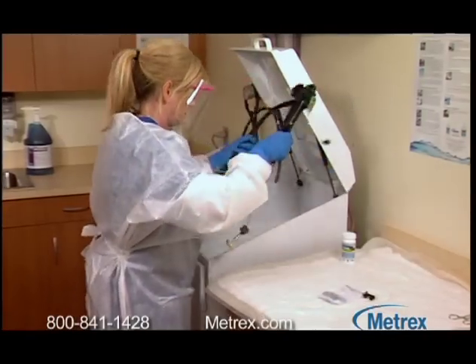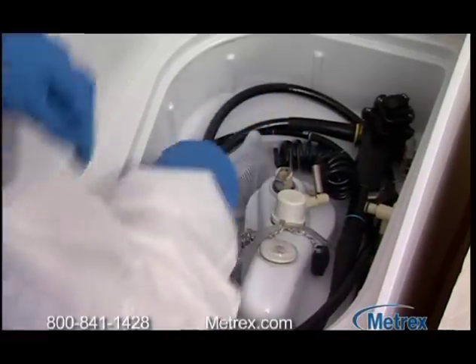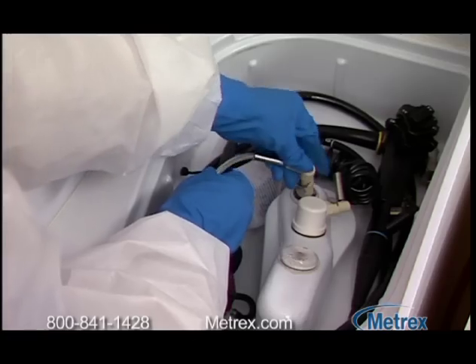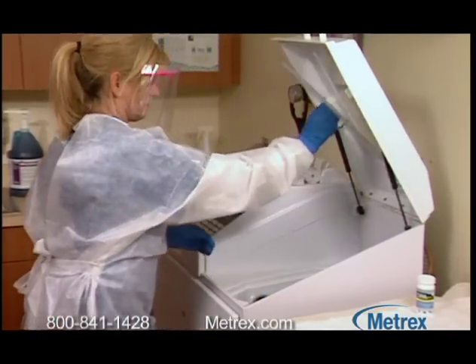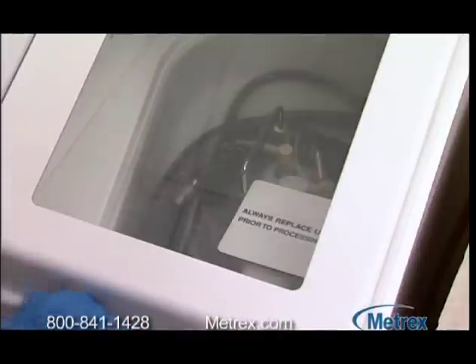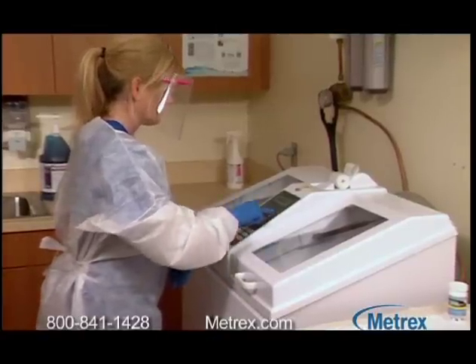High-level disinfection is the process that eliminates many pathogenic or disease-causing organisms, except bacterial spores, on reusable semi-critical medical instruments or devices. Semi-critical devices are instruments that come in contact with mucus membranes, such as reusable flexible endoscopes, respiratory equipment, and anesthesia equipment.